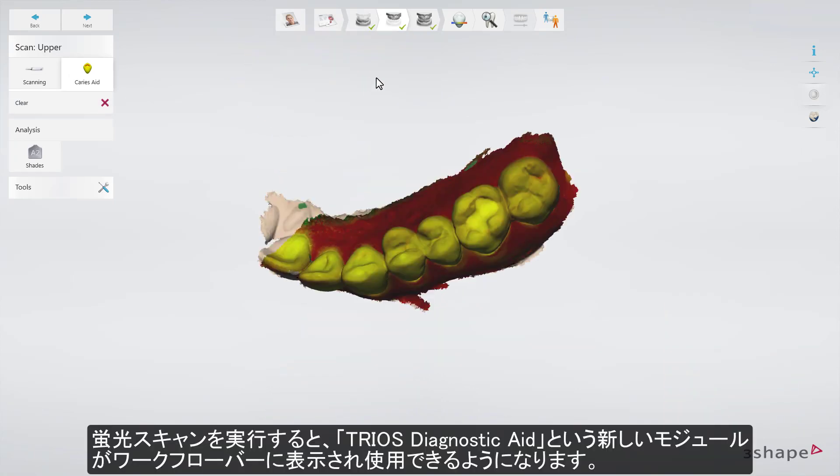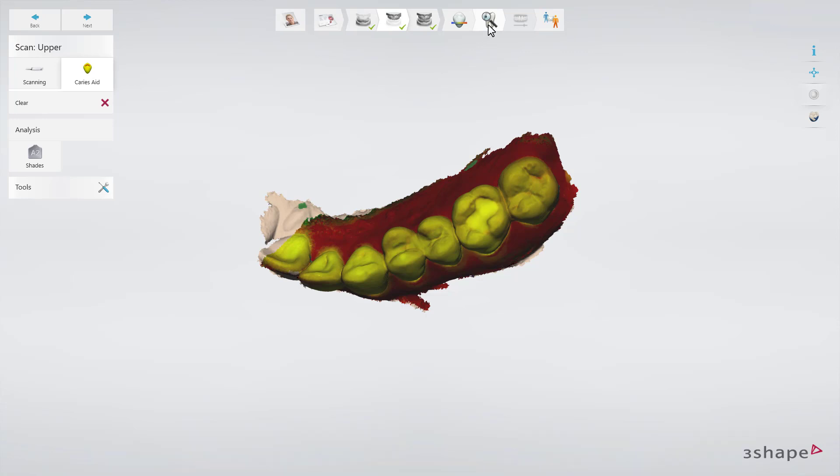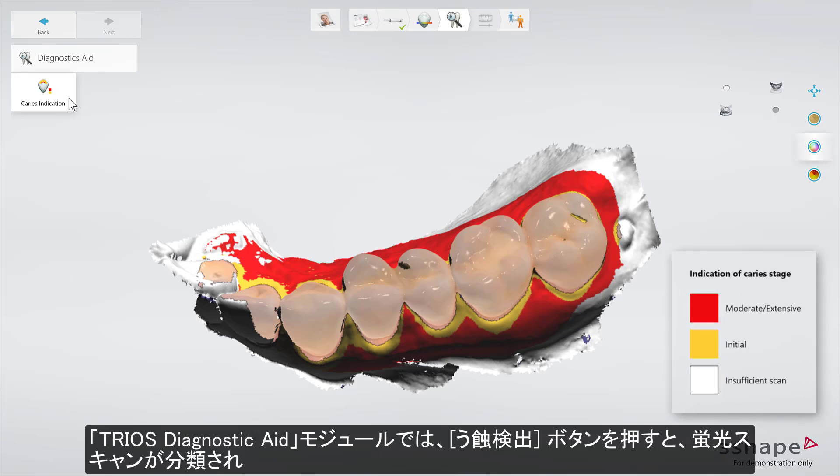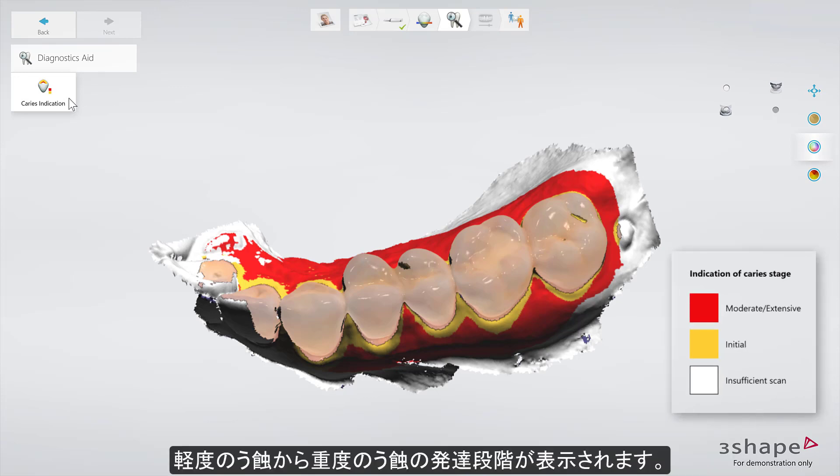Having performed Fluorescence Scanning, a new module called TRIOS Diagnostic Aid will become available in the workflow bar. In the TRIOS Diagnostic Aid module, you can press the Caries Indication button, and the Fluorescence Scan is categorized to indicate the stages of caries development, ranging from initial caries through moderate to extensive.